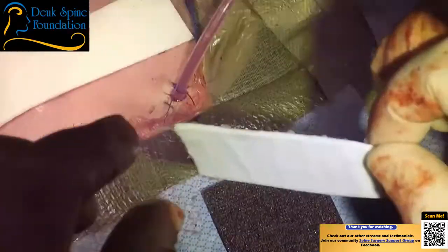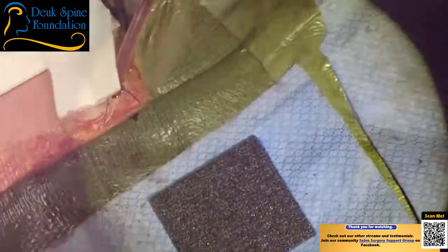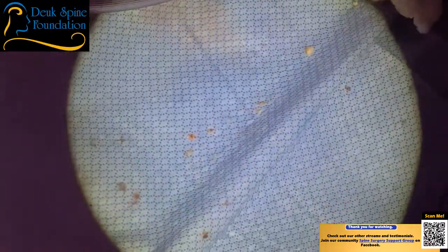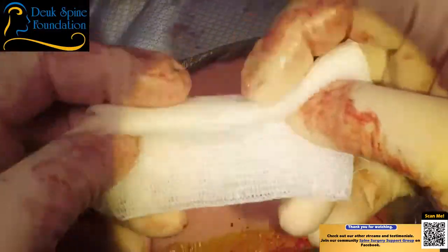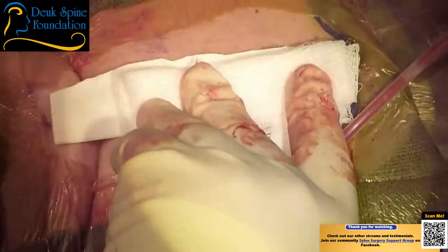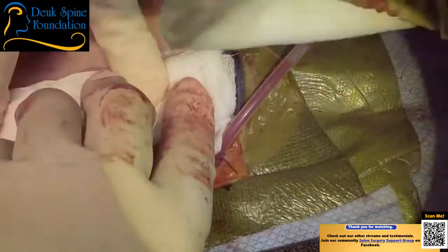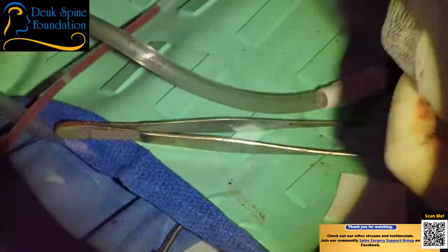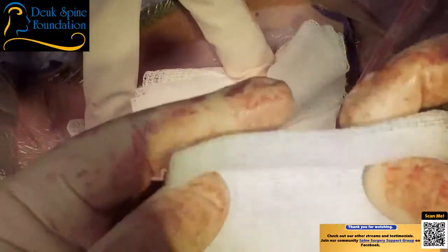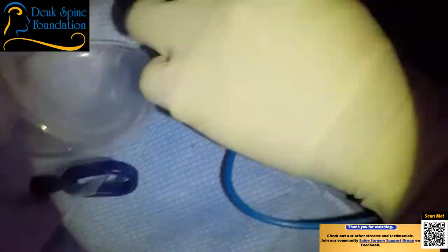Steri-strips. Let's do one more right through the middle. No, I want the 4x4s. Oh, good. Yeah, the paper tape ready with the scissor clean. I need a lap. Where's the drain? I need the drain. I need a lap. Careful. Nice and straight. Let me have the lap. A clean lap.